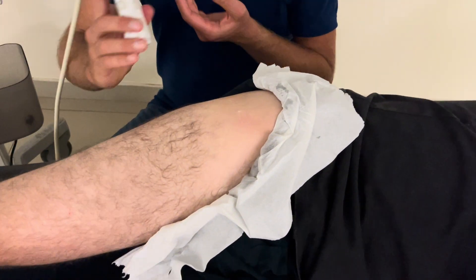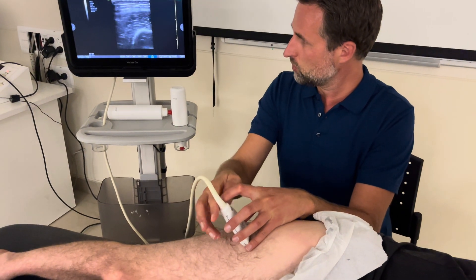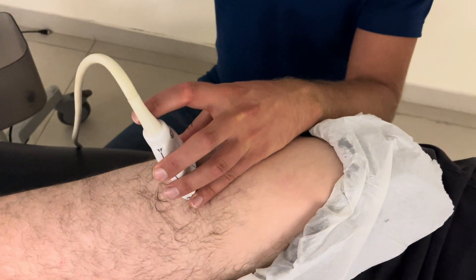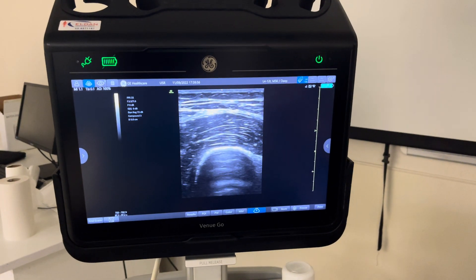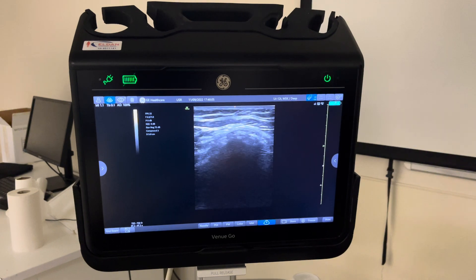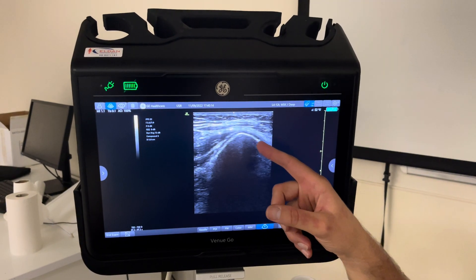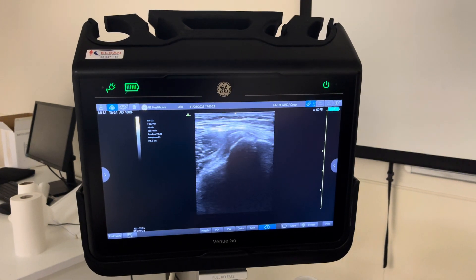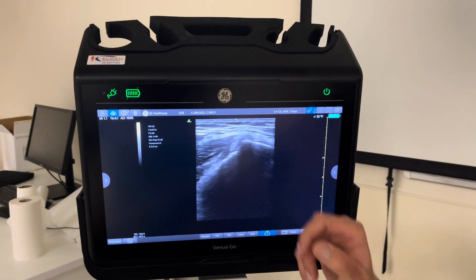We're going to start scanning using a very important landmark. Easiest is to start on the femur on the lateral thigh. There you have the image of the vastus lateralis and intermedius, and beneath it the bone of the femur. Then we go proximal until the bone comes more and more superficial. What you're going to look for is this bony eminence right there in the middle — it looks a bit like a pointy mountain.